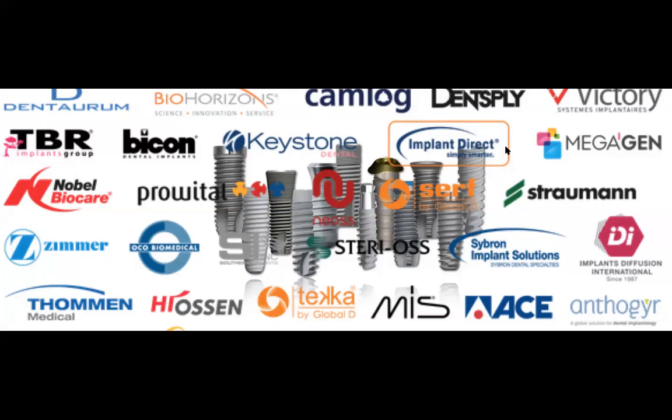If you have easy or very diverse prosthetic options on those implants, all of a sudden that implant becomes very attractive, because obviously everybody knows patients come to our offices, or to the university, not because they want to get an implant surgery or a bone graft. They are coming in because they want teeth. So if you're choosing an implant system, that implant system should have very diverse and very strong prosthetic options.